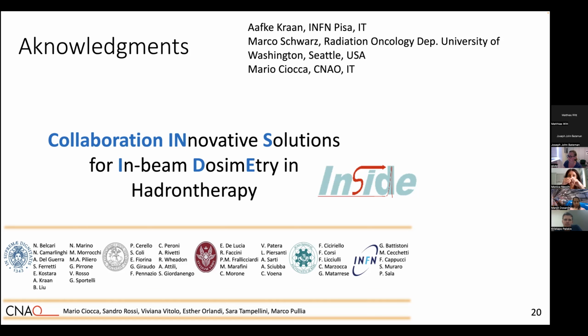the treatment planning. I mean, with this system, you can extract the dependencies of the attenuation coefficients from the energy in a direct way, and this information can be put into the TPS for the calculation of the stopping power of the tissues. So I think this is the future. And also magnetic resonance, but I think it's a way long to reach this maturity.